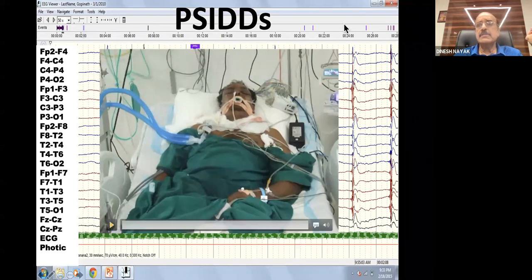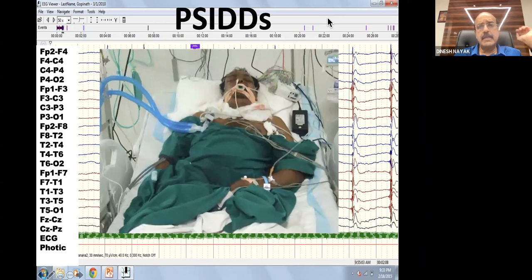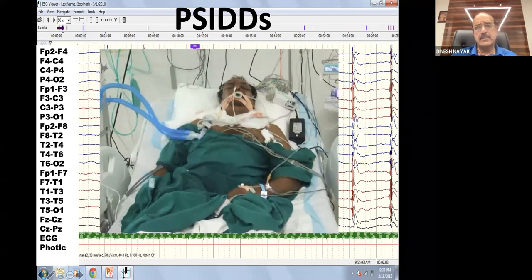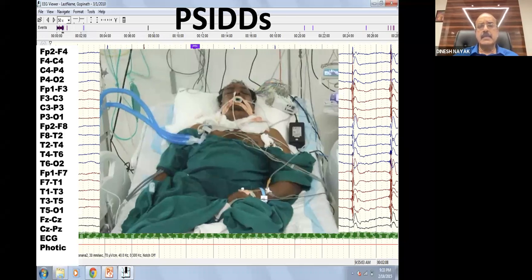Unfortunately, this gentleman has suffered a cardiac arrest. In the first 6 hours after cardiac arrest, he has survived, but he has gone into severe cerebral hypoxia. There is cortical laminar necrosis, a disconnection between the cortex and the subcortex. Usually you'll have these kinds of myoclonic jerks. And the EEG during this time shows short interval diffuse discharges with burst suppression between the bursts.